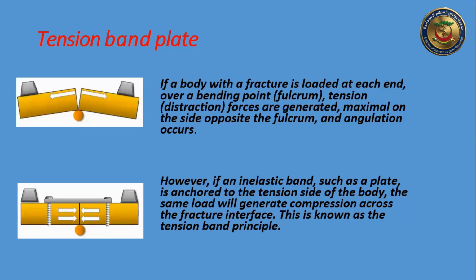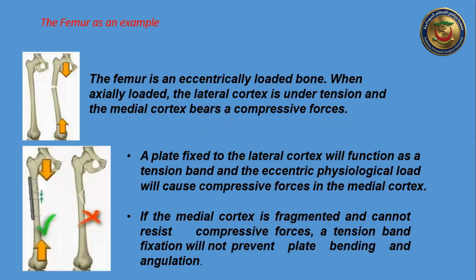The most famous example is the femur shaft. It is not amenable in a comminuted or fragmentary medial wall or fragmentary fulcrum. These are the principles of plate fixation mentioned by Dr. Beshendi.